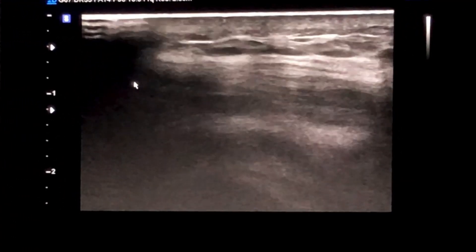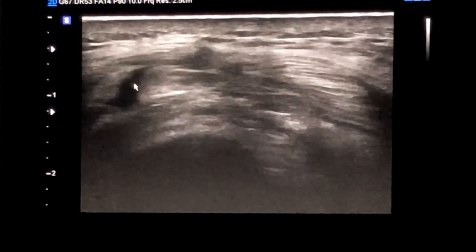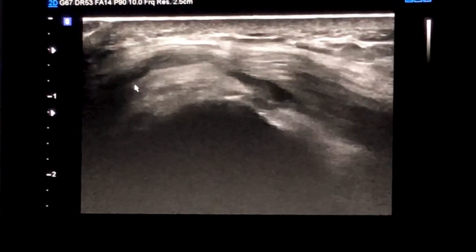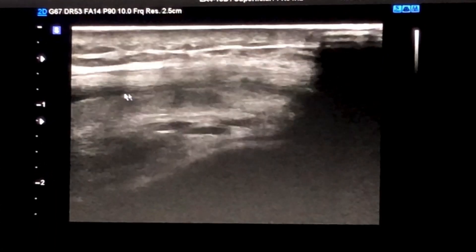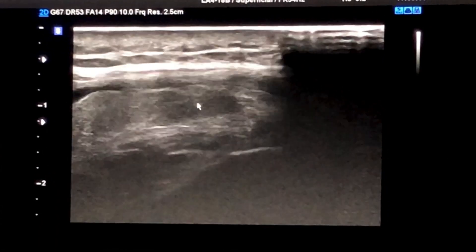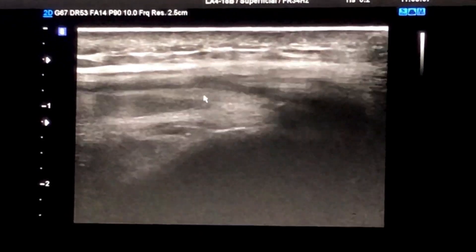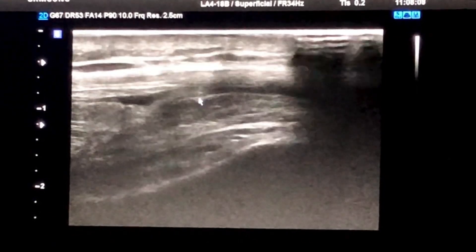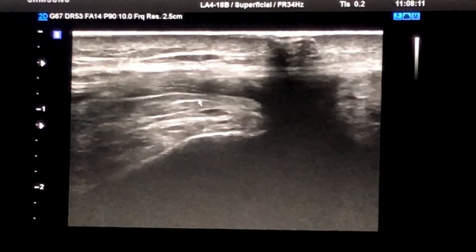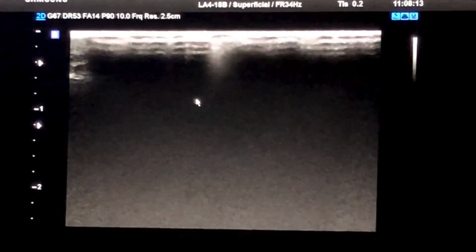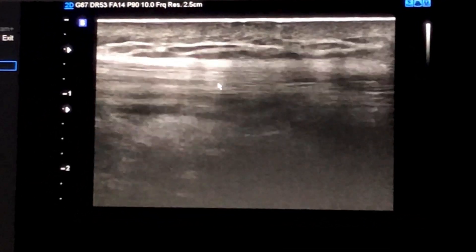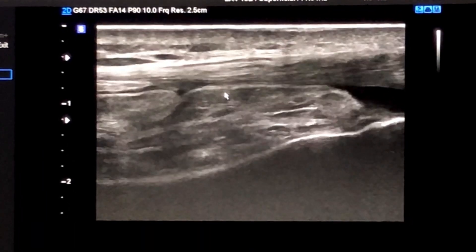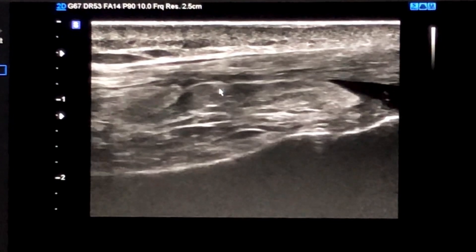Unfortunately there is not much fluid here, but we try to change the degree of flexion to see more fluid. I flex less now to see if pressing on the medial side redirects the fluid laterally. The image you see there is related to fat, not synovium.